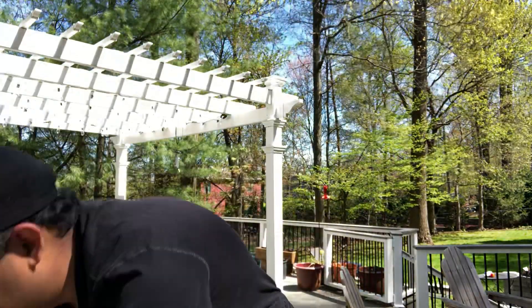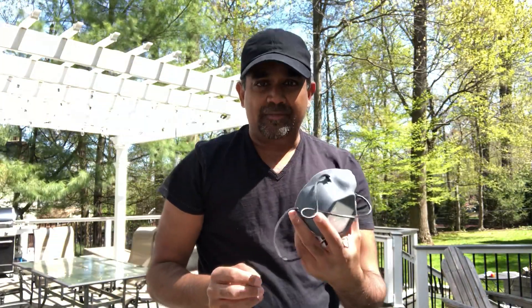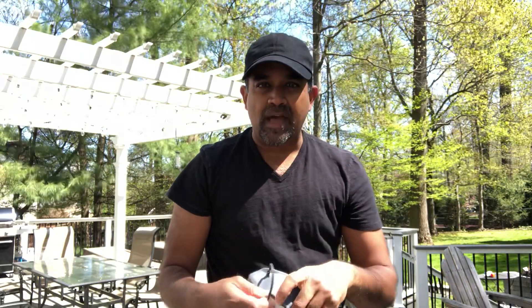The other option we have is these DIY N95 respirators — these are called Montana masks. There are sites like Thingiverse where you can download these for 3D printers. The problem is that most 3D printed ones aren't custom made — they come in small, medium, and large. You can print it on any hobby 3D printer, but when you print it out, it may not fit your face. So what we've been doing is using the Bellis 3D scan to create a custom facial mask about five millimeters thick, fit to the particular person.